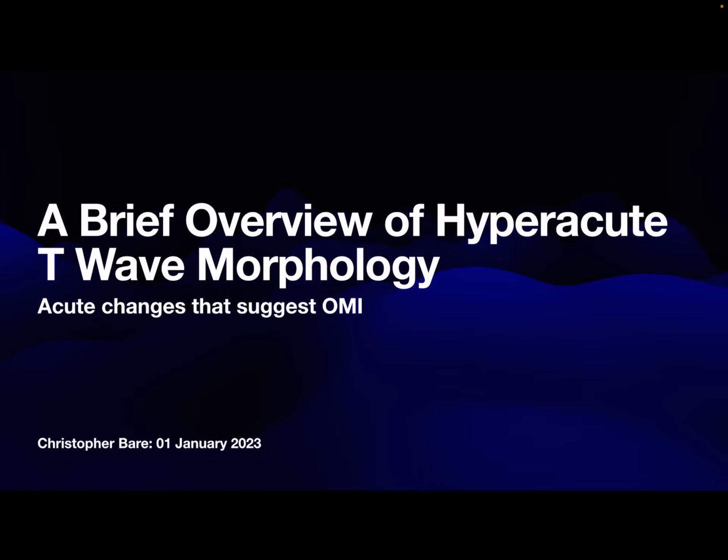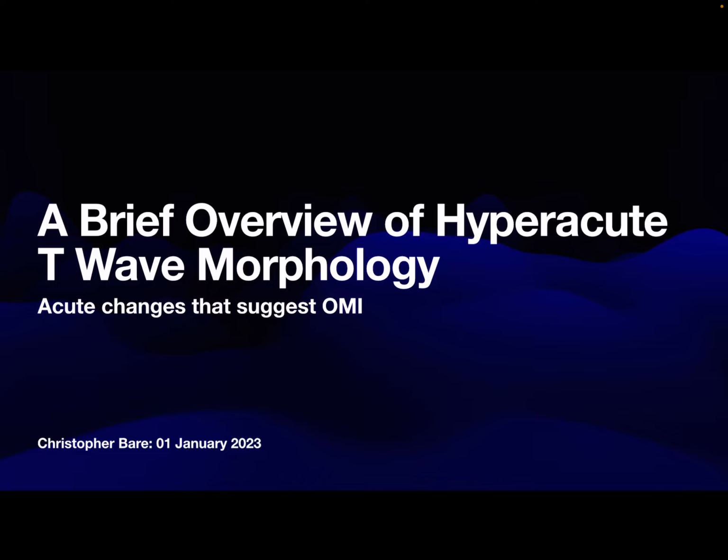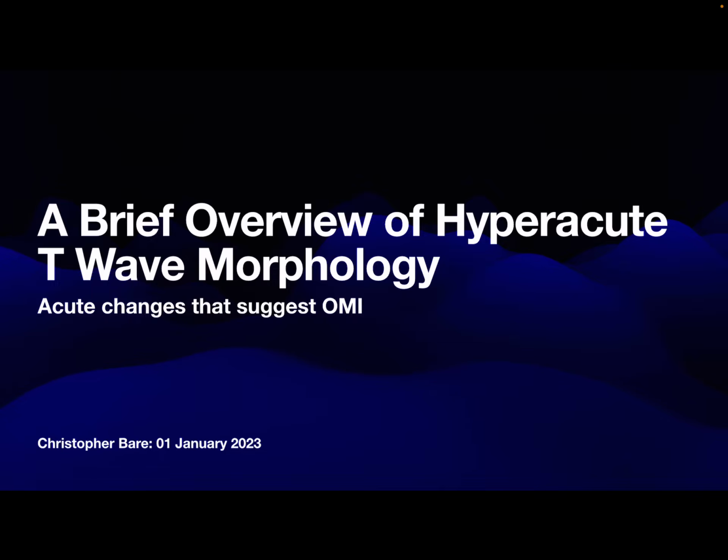And I've talked in prior videos about the STEMI versus OMI paradigm and how the OMI paradigm is probably a better, broader, more inclusive paradigm we should be transitioning to. However, these particular videos that I'm working on are focused more on talking about the findings that are considered equivalent to STEMI as opposed to STEMI versus OMI and NOMI paradigms. So, hyperacute T waves are one of the four STEMI equivalents. We talked about De Winter T waves in the prior video.